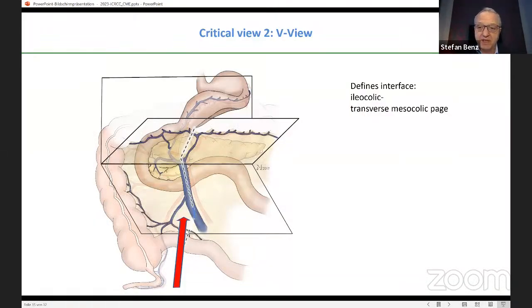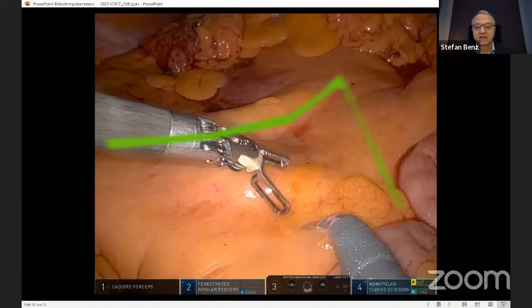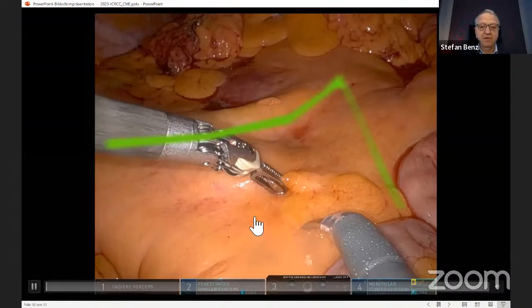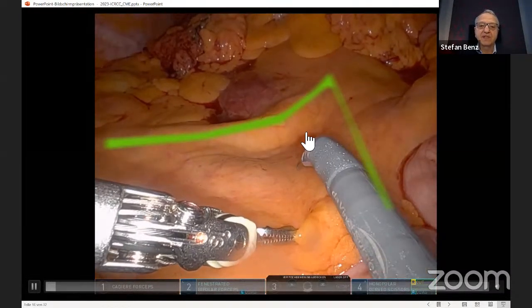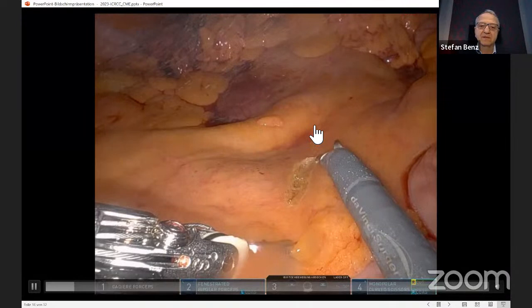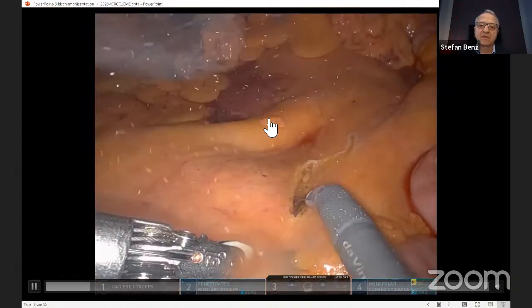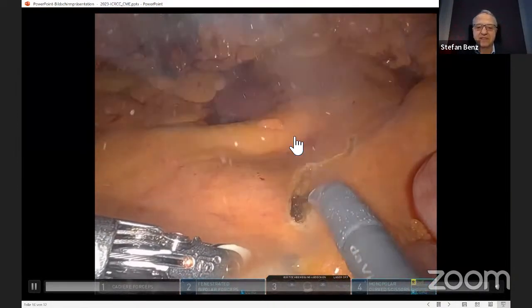Then we have to turn the patient head up and tilt it to the left side, and we identify the angle between the ileocolic and the superior mesenteric vessels, which is a V-shaped configuration, and we incise in the angle in between and reach the dorsal dissection plane we've just created. That's the V. And you see already the small hematoma here. And the advantage is the entire lymphatic drainage area remains intact. Now we reach the dorsal dissection plane.